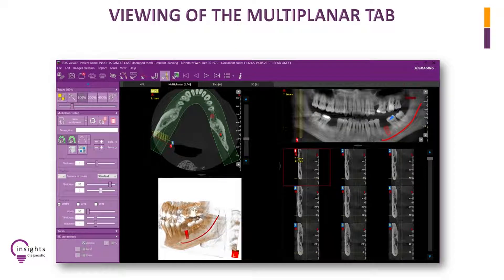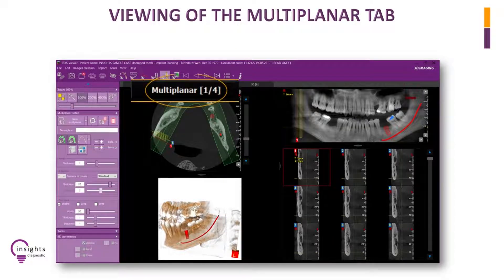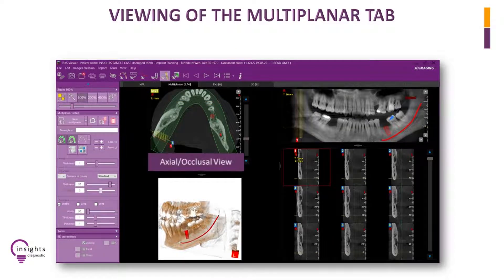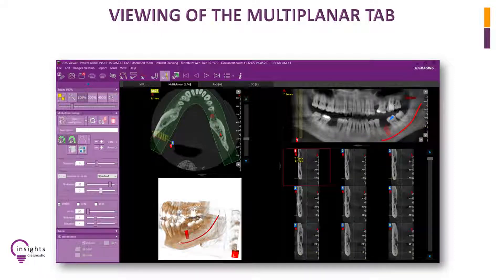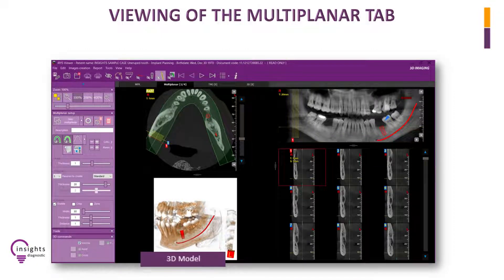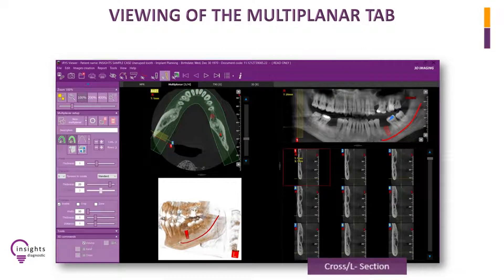This is how it appears when viewing the Multiplanar Tab. On the upper left is the axial, or occlusal, or superior-inferior view. On the upper right is the panoramic version. On the lower left is the 3D model. On the lower right is the cross-section view.